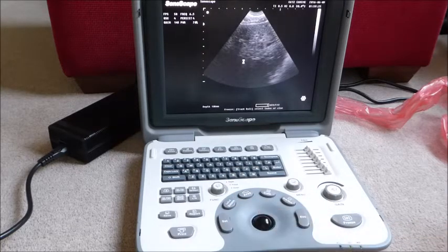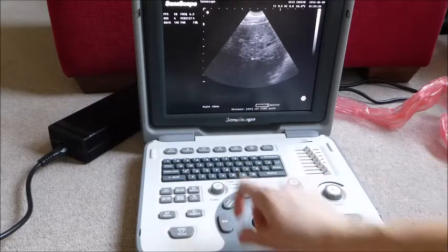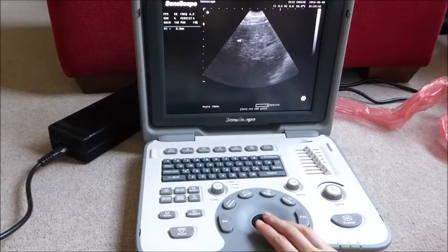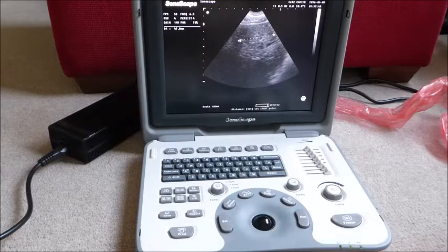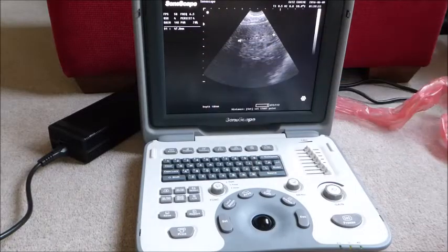The other thing you can do here on this screen is you can take measurements. You may not want to do that immediately if you're just getting used to your machine, but it's pretty simple. There's a distance button here. Press that and you would just set your point here, and then wherever you wanted to go to, imagining a sac again, but say it was there, and then it's going to come up on the screen, it's going to tell you the distance between those 2 points.